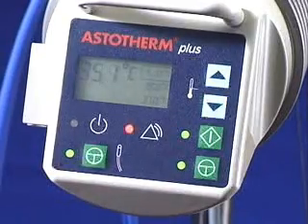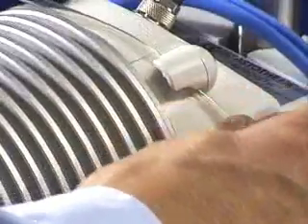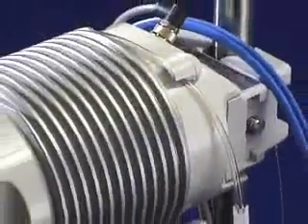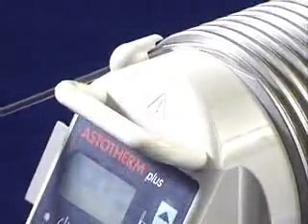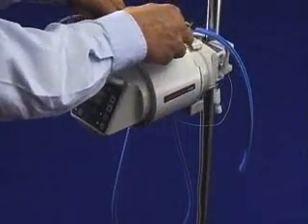The heater is started. The infusion extension is fixed and the line is wrapped around the heating cylinder. The line is fixed at the front as well. The heat protection sleeve is placed around the heating cylinder.